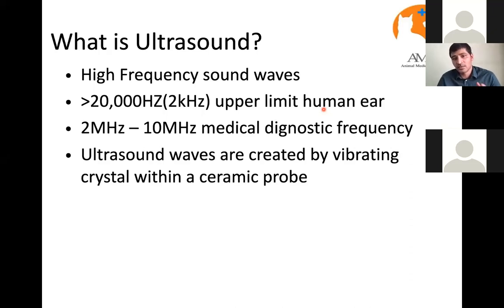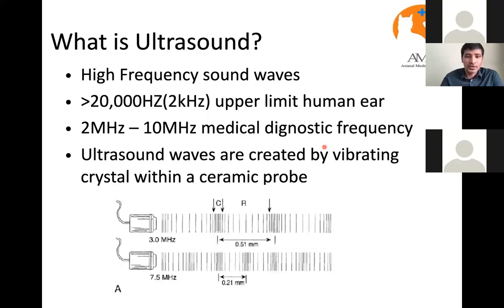I'm focusing on the frequency of the sound wave that we use for diagnostic or medical purposes. There are different frequencies that we use. Later we will discuss the importance of different frequencies. It doesn't matter whether higher frequency or lower frequency, they all have their own importance. So we will discuss that.